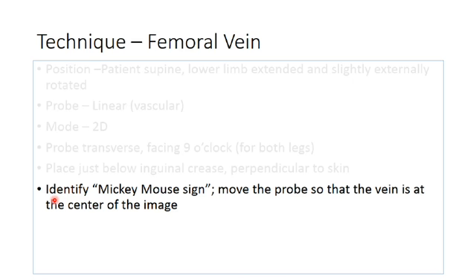For this, you might have to rotate the probe slightly one way or the other in order to get all 3.